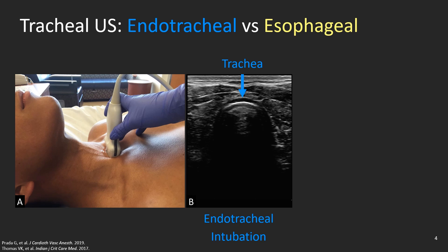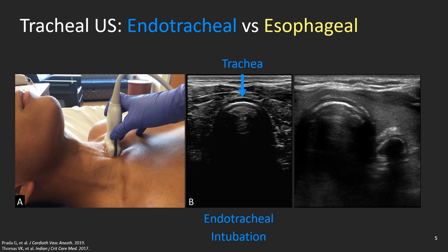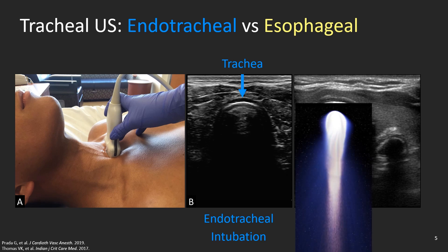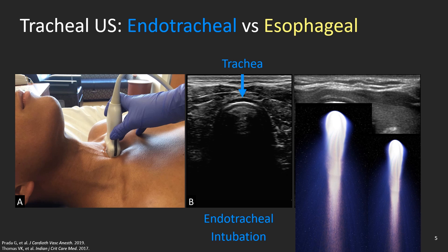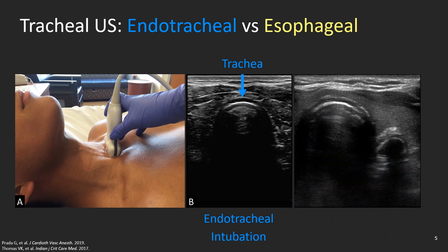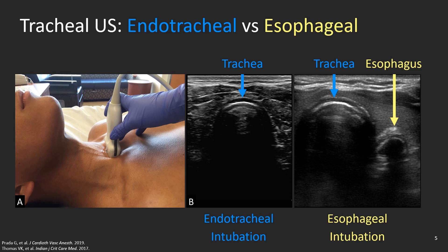In contrast, when the tube accidentally goes inside the esophagus, you will see two comet tail images. Do you see them? Let me help you. Here is one and here is the other one. The comet on the left corresponds to the trachea while the comet on the right corresponds to the tube inside the esophagus, mimicking a second airway. Remember that normally the esophagus is collapsed without air inside. A collapsed esophagus is indistinguishable from its surrounding soft tissue, so you cannot normally see it. If you see it, it's because there is a tube inside it.